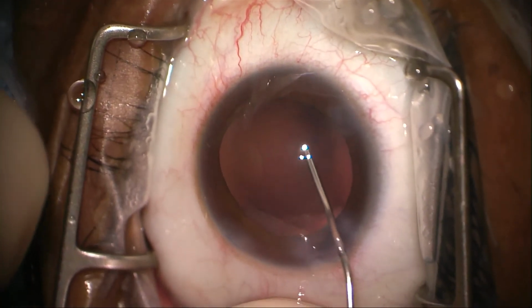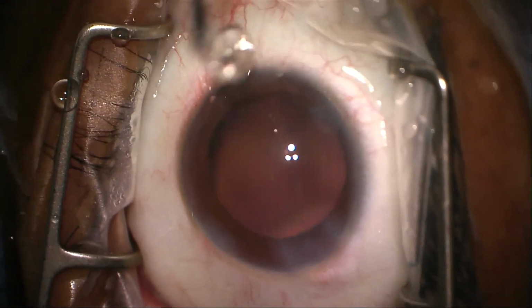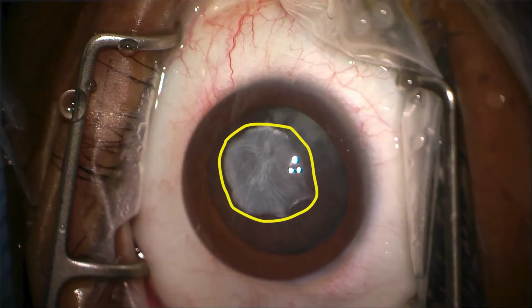The rest of the case is going to be pretty routine, and there's one more thing that I want to draw your attention to, and it relates to the size of the rhexis. To help point that out, I have taken screenshots back when I was using the scissors to cut the capsulorhexis and represented that by this yellow line. See the tension lines that are there too.